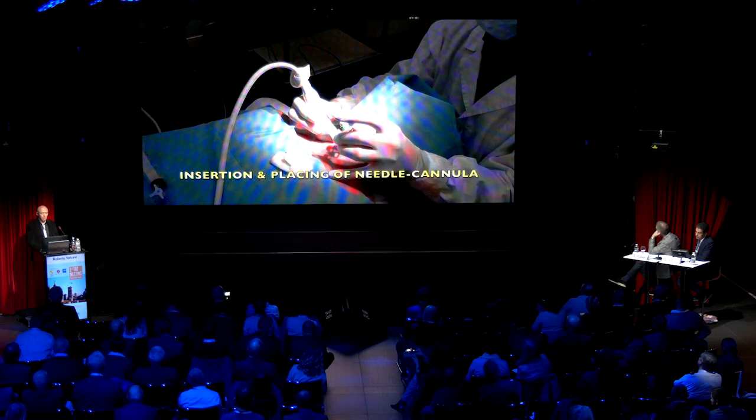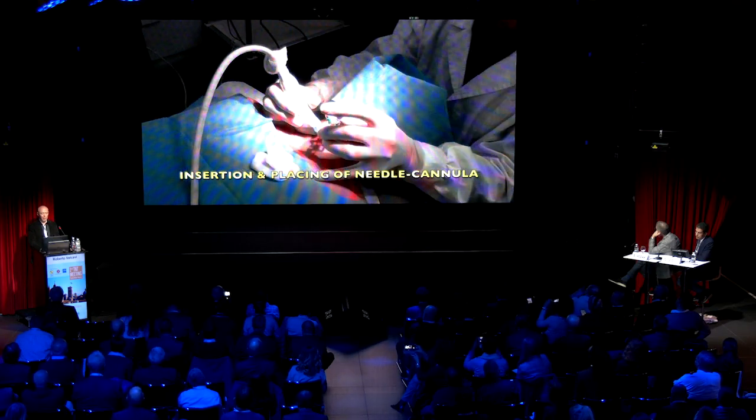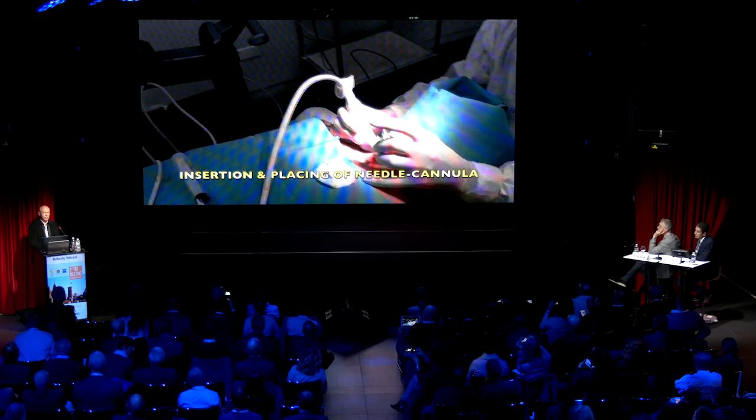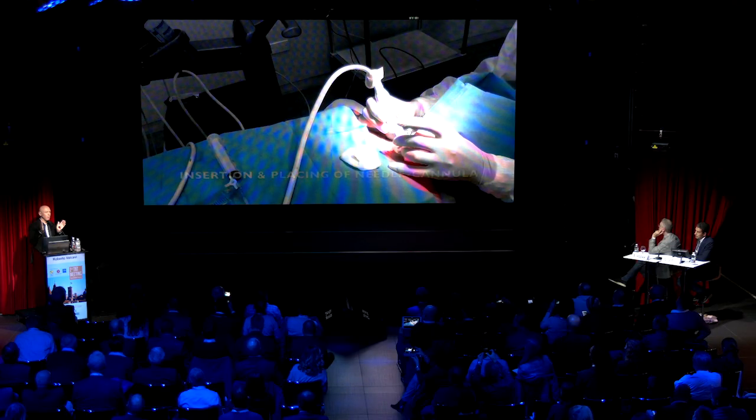And a venous plastic cannula is then inserted. I use a cannula rather than a standard steel needle because once the cannula is placed and the stylet is withdrawn, there is no risk to move the needle from part to part of the cyst, which could happen especially if the patient would swallow.